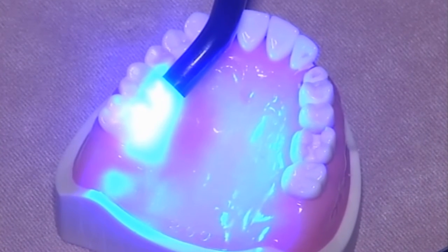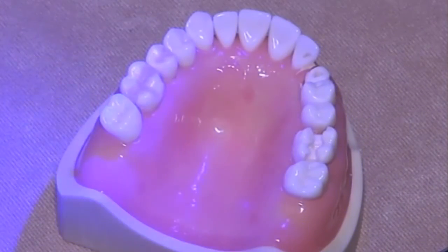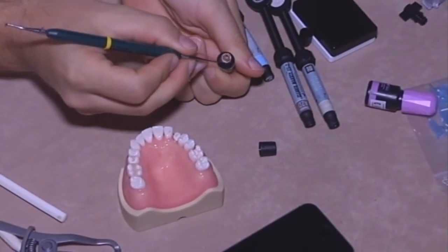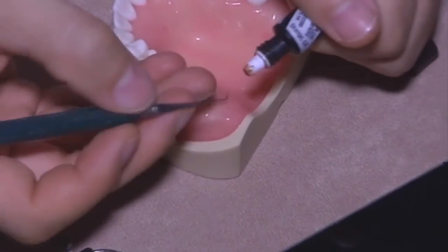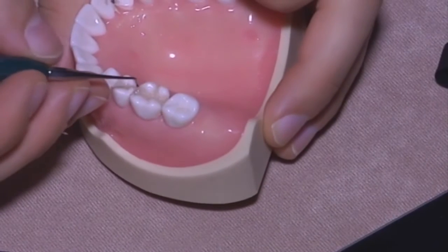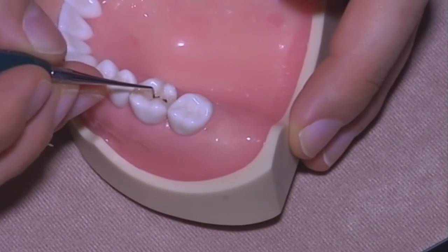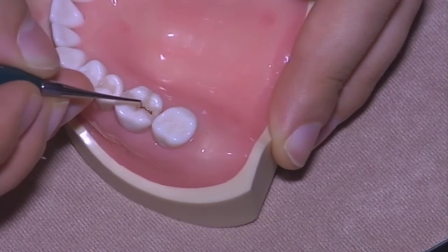Just to complete, you know that I am a little bit maniacal in aesthetics, and so why not a little bit of brown in the sulcus? But in order to work, you need to design the sulcus.